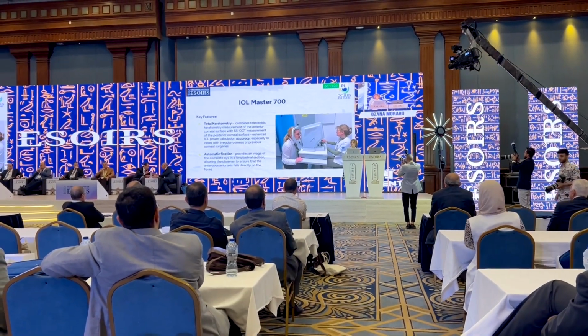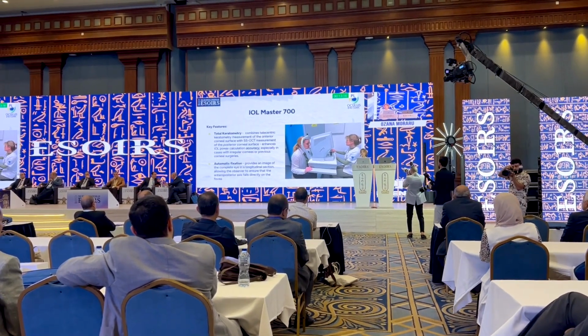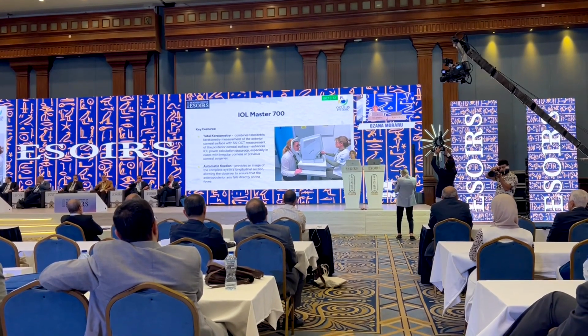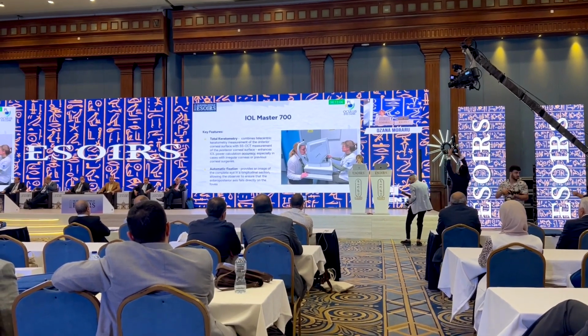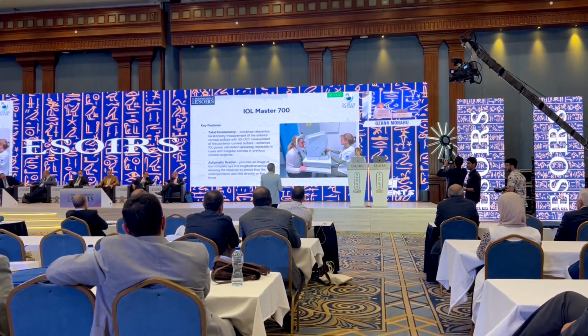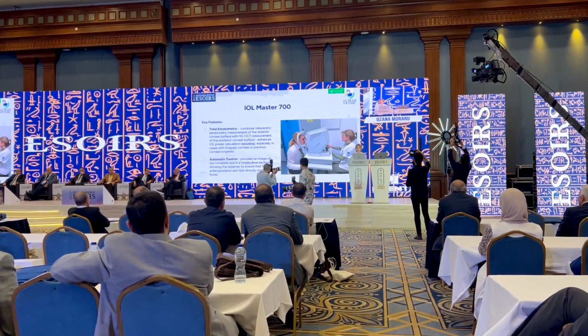And every time when you have several machines for the same purpose, we have this tendency to compare the results. So at least initially, we perform in several cases the biometry with several machines, just to have an idea and to make comparison and to decide at the end on which machine we will stay, let's say, especially in most difficult cases.